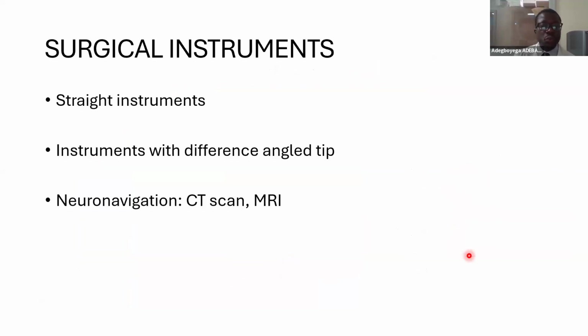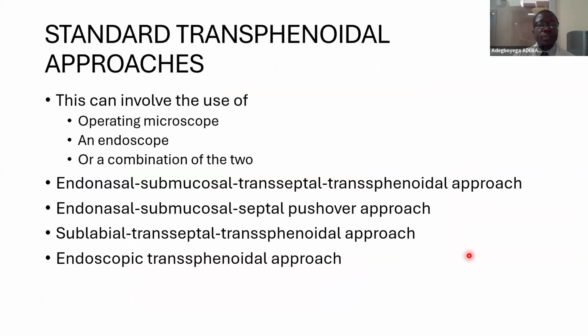Also, one needs to be conversant with surgical instruments as well. As earlier stated, the transsphenoidal approach can be done endoscopically or using a microscope, but one can combine the two. We then have endoscopically assisted microsurgery, transsphenoidal microsurgery.